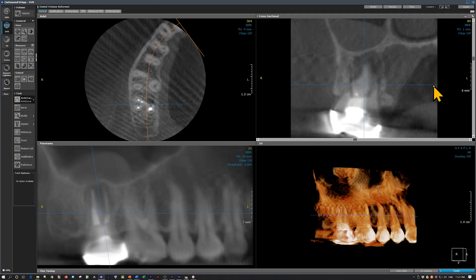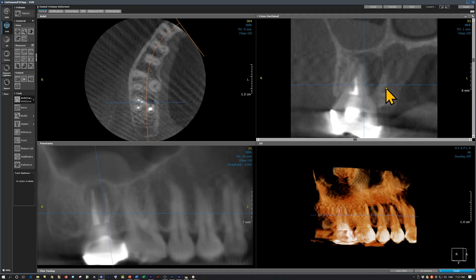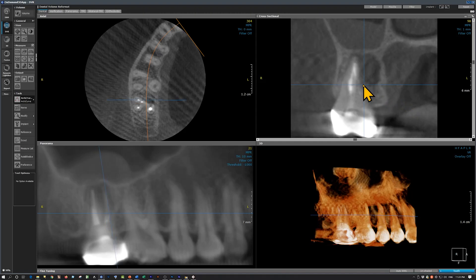As we move mesially, these are the mesial roots. Both root canals are obturated and I am going back and forth to show you both canals. On this image also, we can see that the palatal cortical plate is perforated. Overall, the lesion is circular but there are some irregularities. Such findings are usually associated with an infected radicular cyst.